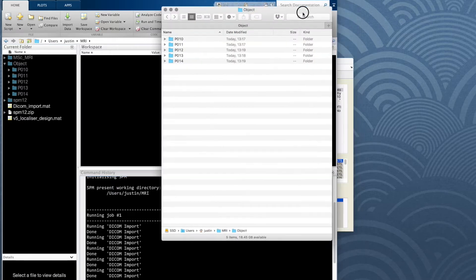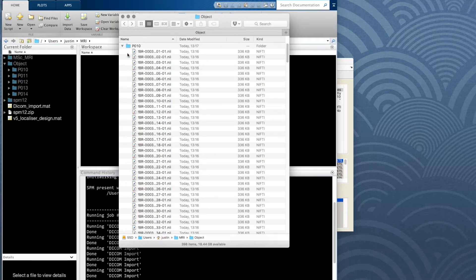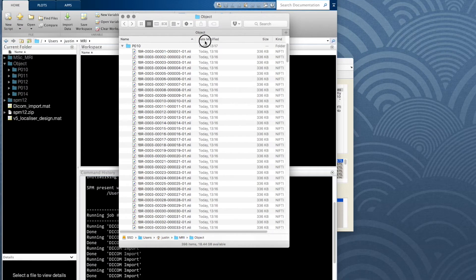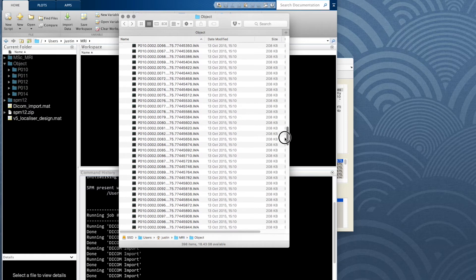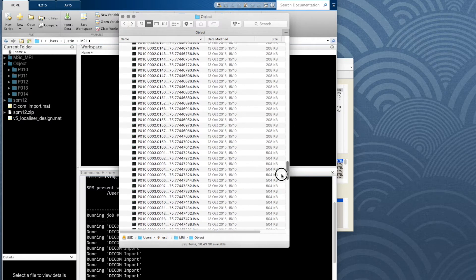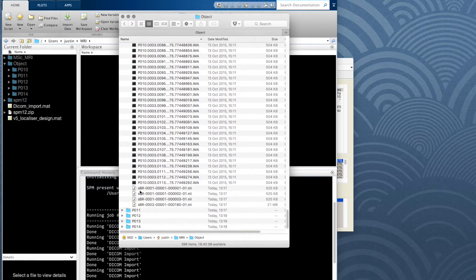Always check what it's done. If we go back to the directory with the images, we see some new images have been created with an F prefix and a .nii suffix. These are the functional images — the EPI sequence from the experiment. In addition to the original DICOM images, we also have some S-prefixed images, S for structural. The first three we can just delete because those are the orthogonal localizer images taken at the beginning of the session to check the participant's position in the scanner.